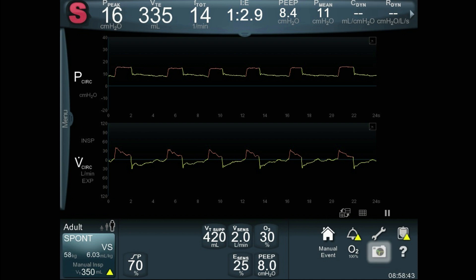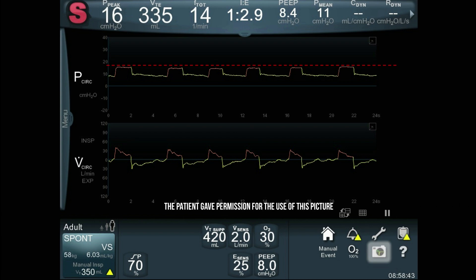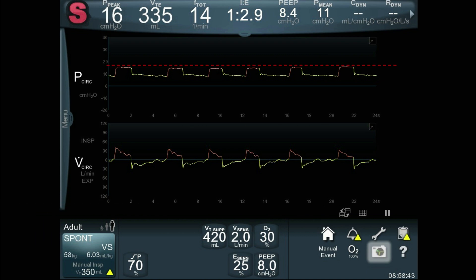Volume support may also be useful in patients who are slow to wean from mechanical ventilation or who have deteriorated. This patient has a size 5.5 tracheostomy tube and had an aspiration event, and there was some difficulty getting the pressure support level right, so we put him on volume support. The tidal volumes are very variable and the current tidal volume is 335 mils — you might think it's not doing its job, but if you average his tidal volumes over a minute, he did get 420 mils. It was really reassuring that this patient was being adequately ventilated despite having a very small airway.